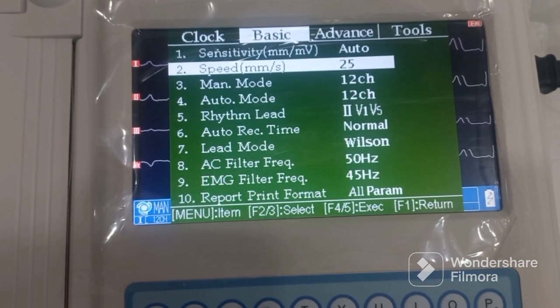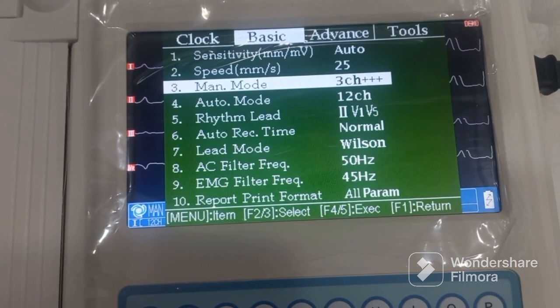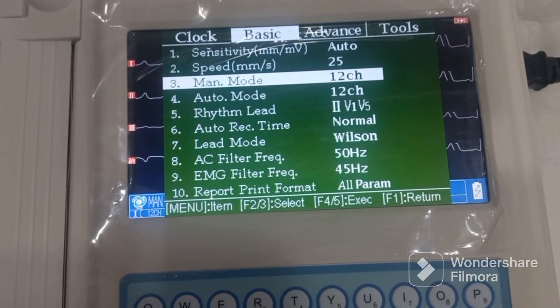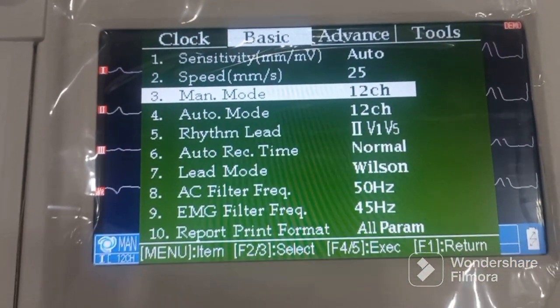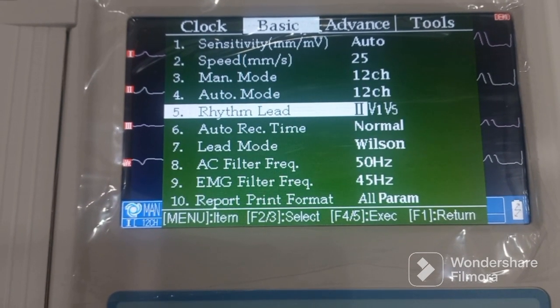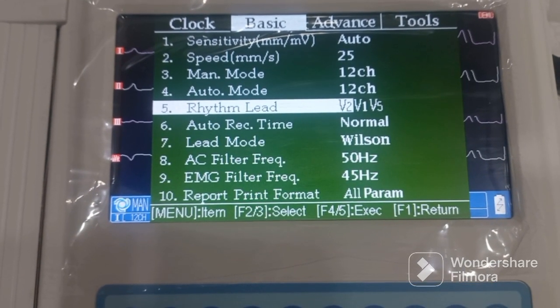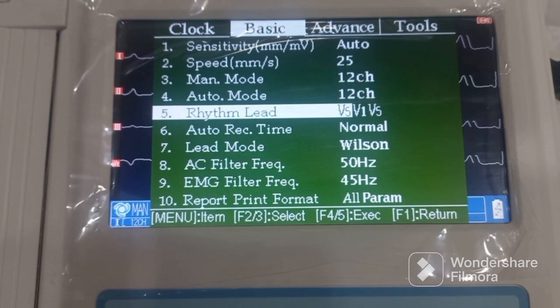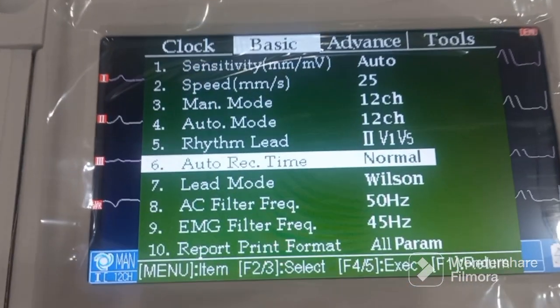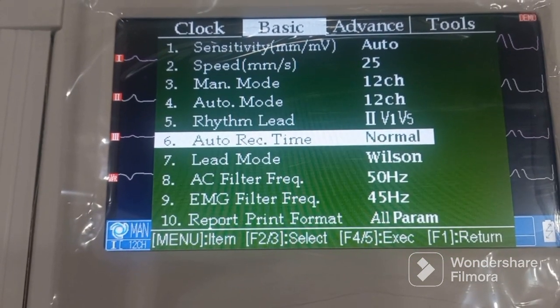In the basic menu you can set the sensitivity, printing speed, and in manual mode configure whether you want 12-channel, 3-channel, 6-channel — there are many configurations. You can set the rhythm lead — most commonly set to lead II, and by default it comes on lead II. There is also the auto record time setting, which is important — if you want to save paper you can make it shorter for a more compact print, or set it longer.